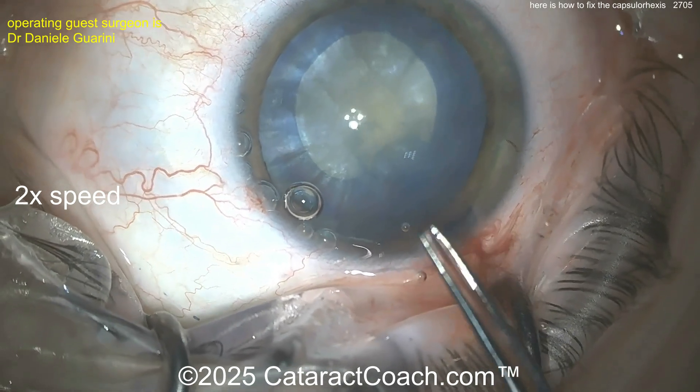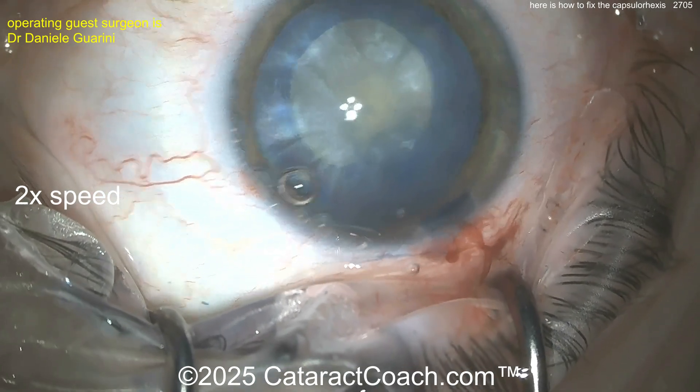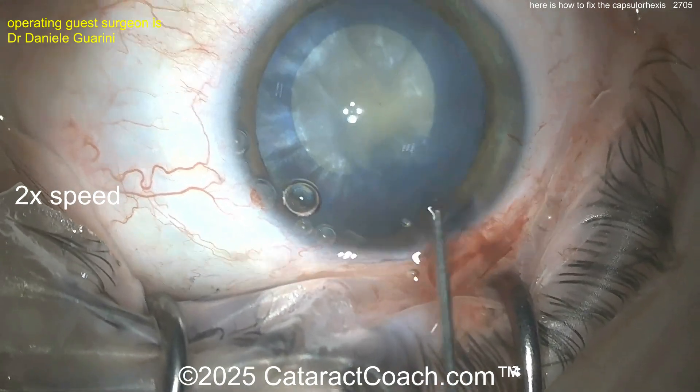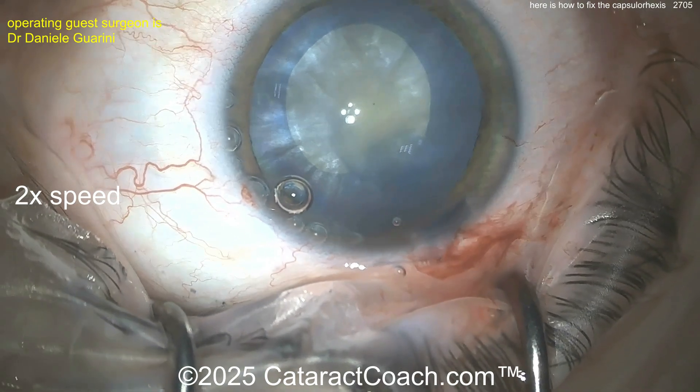What do you want to do here now to fix it? Think about it — what are you going to do here? You can hit the edge of the lens capsule again and then enlarge the rhexis with little crescent shapes. Going in more viscoelastic is always a good choice — always a good option to have more viscoelastic. Viscoelastic is definitely cheaper than vitreous. We know that.